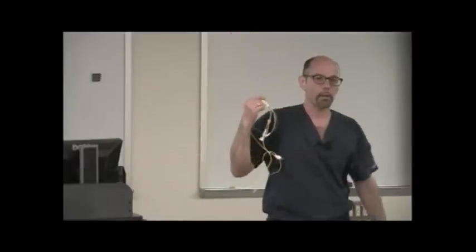There are Swan-Ganz catheters like this that have an oximetry probe on them, on the distal tip, in addition to the balloon and the lumen. So it's measuring the saturation of the blood when it comes back to the pulmonary artery, so all the way through the heart, continuously. So I can monitor the patient continuously. I can see what their arterial sat is. I can see what their venous, it's actually called their mixed venous saturation because it's in the pulmonary artery. It's mixed venous. It's the name it's given. I don't think it's possible right now with any transport monitor to continuously view mixed venous saturation. So in the field, you're not going to have that.